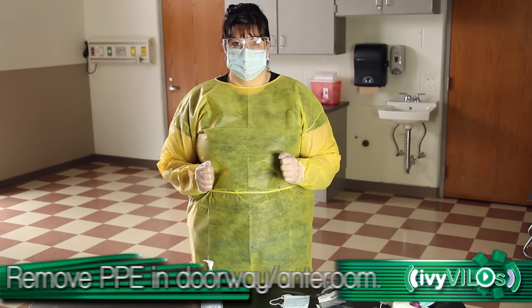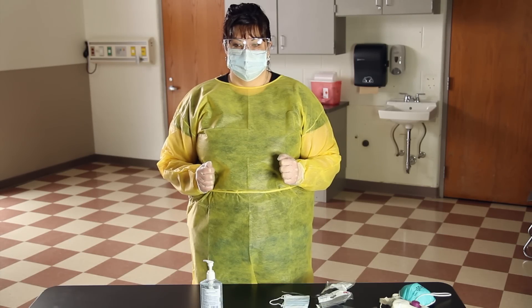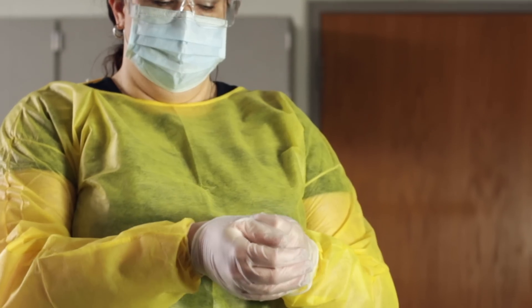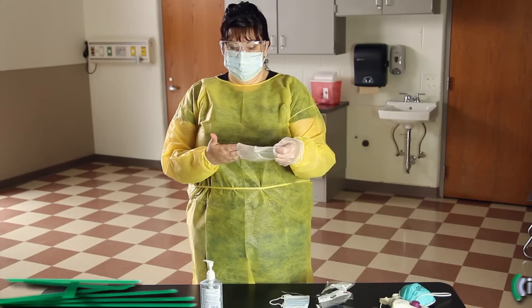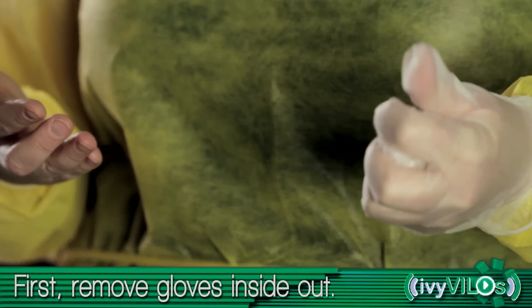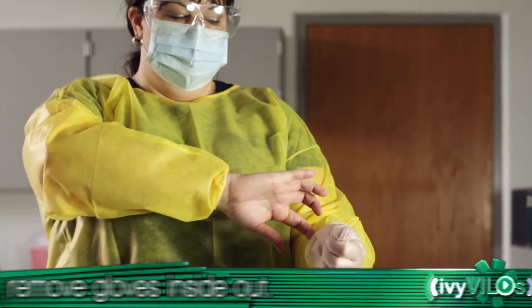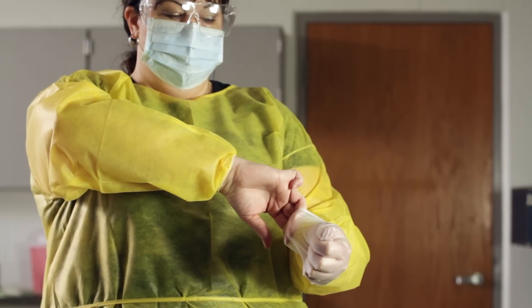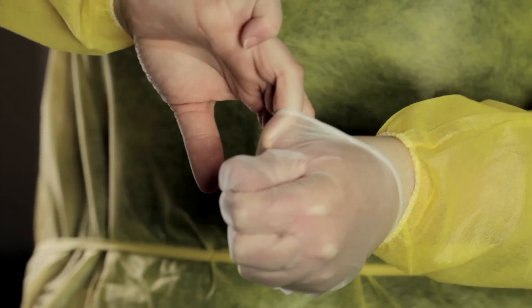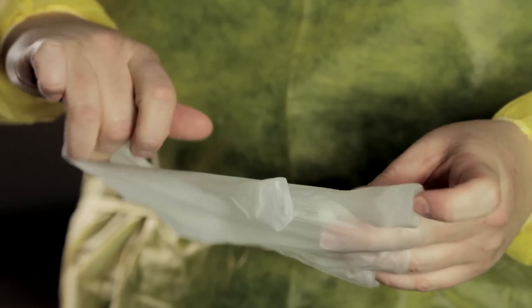Remove personal protective equipment at the doorway or in an anteroom. Remove gloves by removing the first glove inside out with the other gloved hand. Hold the contaminated glove in the palm of the gloved hand. Slide fingers of the ungloved hand under the remaining glove at the wrist, peeling it off inside out. Take care not to touch the outside of the glove.